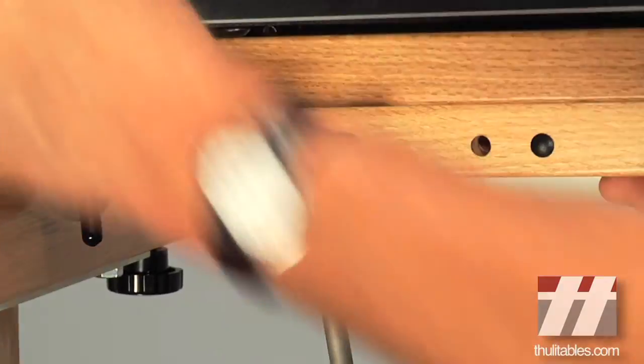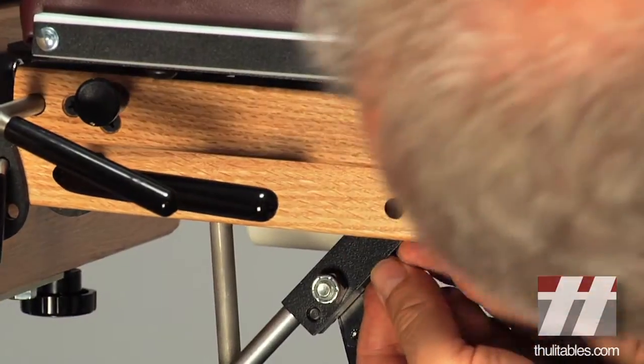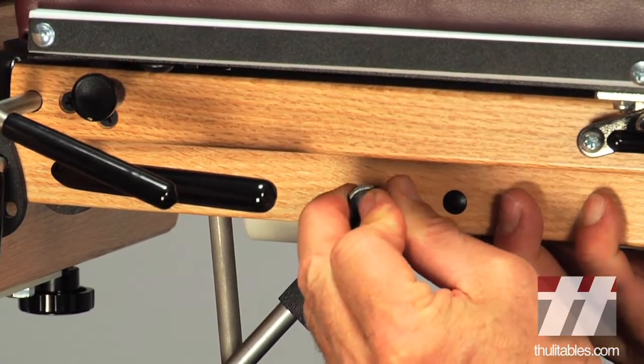Remove the pin on the side of the headpiece, line up the holes on the headpiece and the piston, and reinsert the pin. This locks the headpiece to the flexion extension piston.